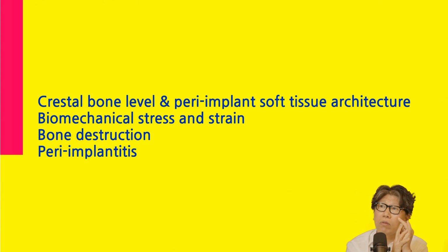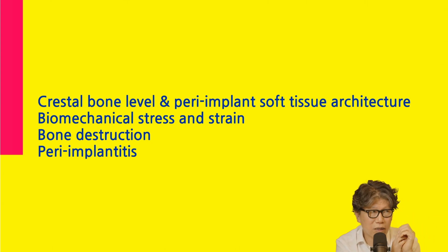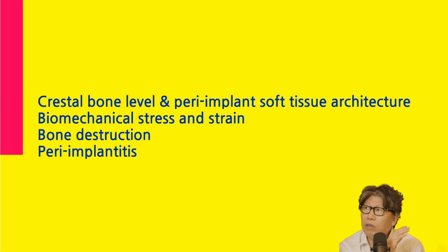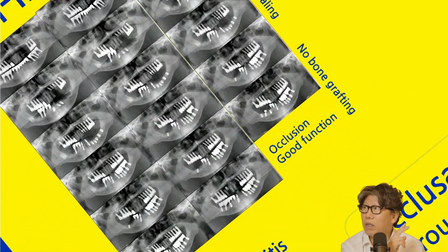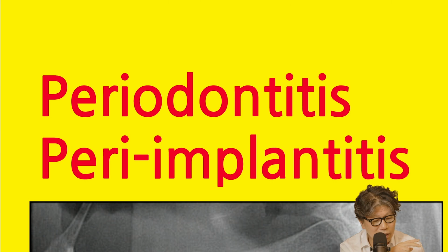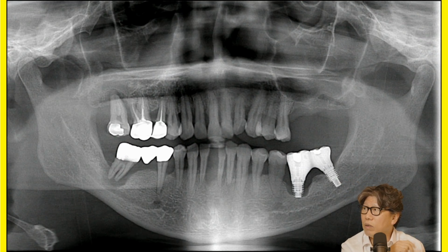What's the next thing you can do? The abutment connection design and the macro design. And I think that's the most important thing that determines the characteristics and the outcome of the implant. So I think we're almost all focusing on macro design these days. So I think you're right about using an implant design that can prevent peri-implantitis. If it melts like this, there's nothing we can do.